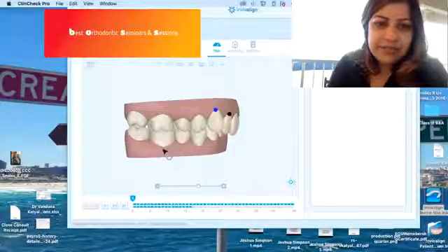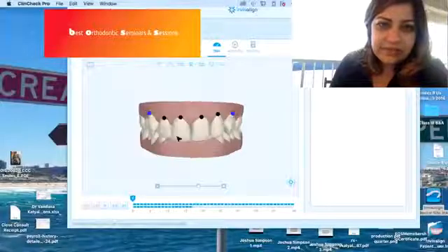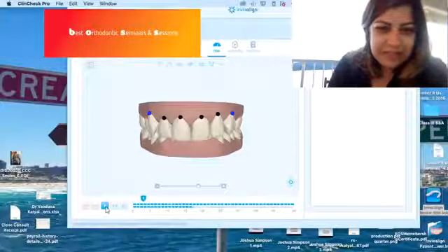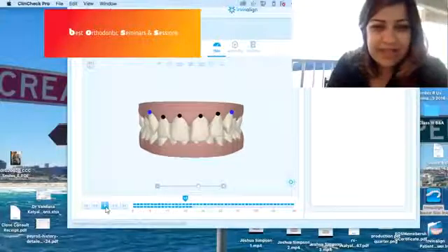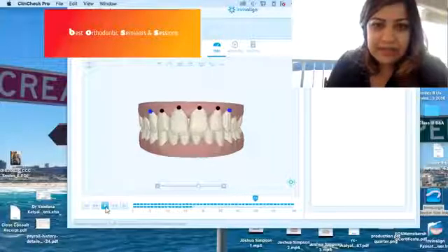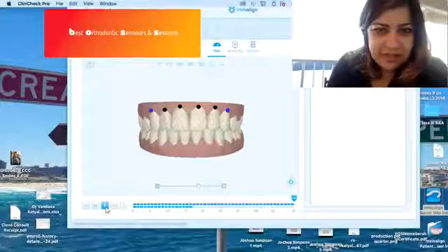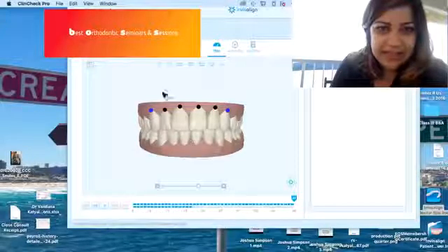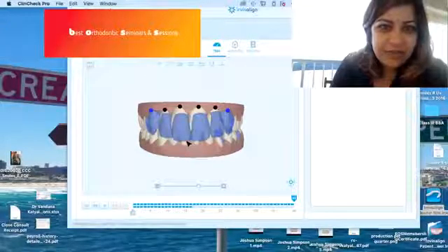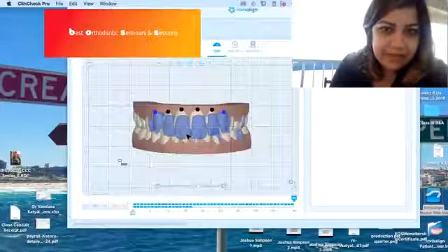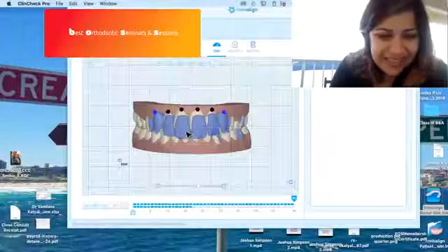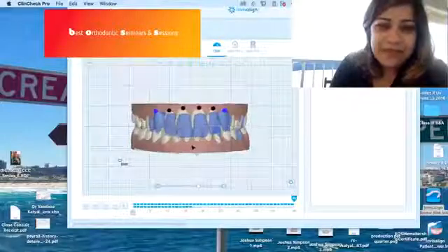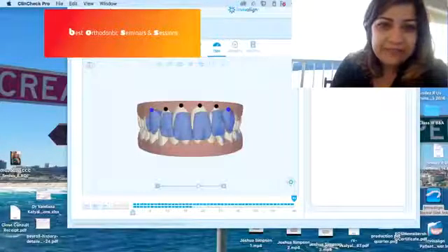Here, the ClinCheck that was first given, let's watch this movie. This is the ClinCheck that's been gone through a lot of revisions by this clinical team. The dentist contacted me and said, look, I'm not happy. Can you please help here? If you look at this ClinCheck, the upper incisors, let's do a superimposition, have been intruded a lot. If we grid it, they've been intruded about 5 millimeters. That is nearly impossible to do with just plastic.